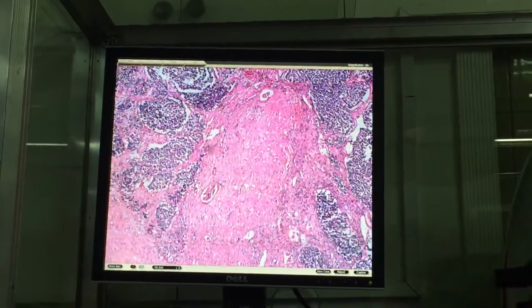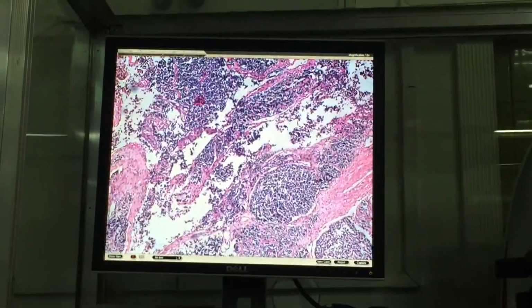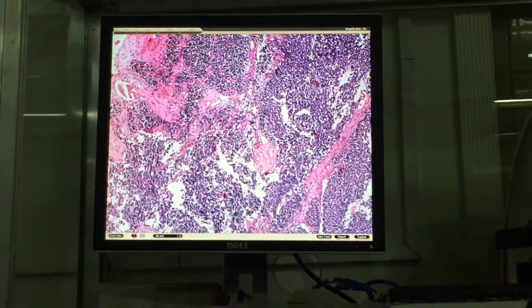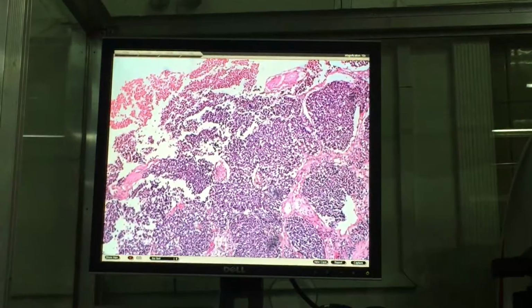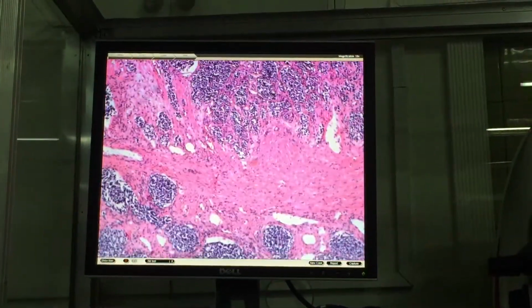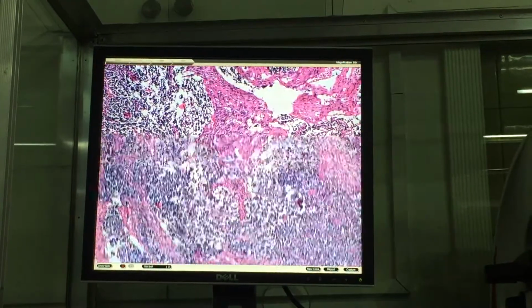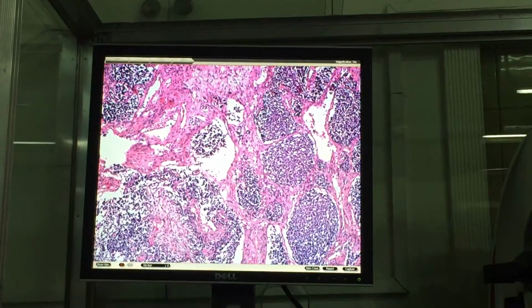Ito na label dito. Wala. Okay, all are blastemal and fibrous.